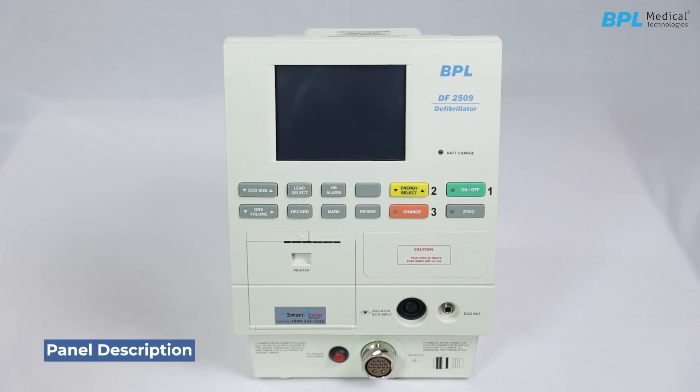Front panel operating controls. On/off key: powers the device. Energy Select: adjusts the energy. Charge key: allows you to charge the paddle to the chosen energy level. Sync: chooses the discharge operating mode — immediate shock or shock synchronized with the next detected R wave.